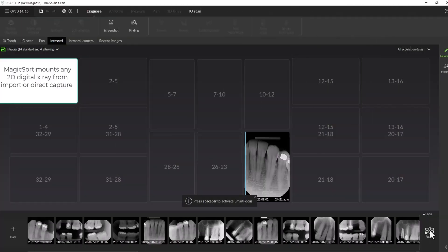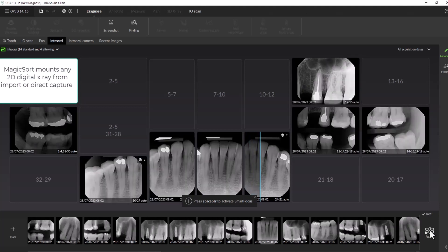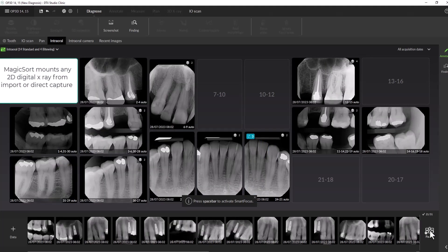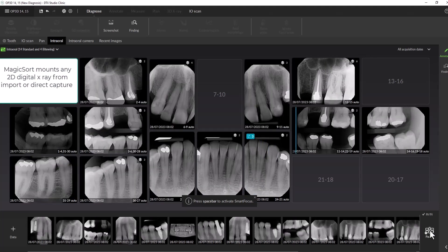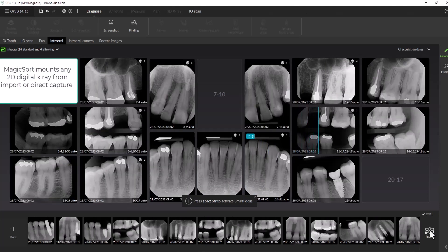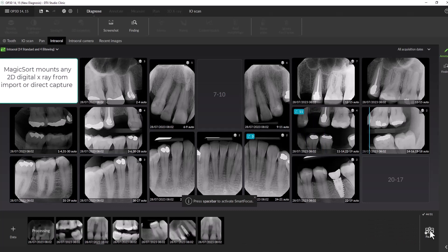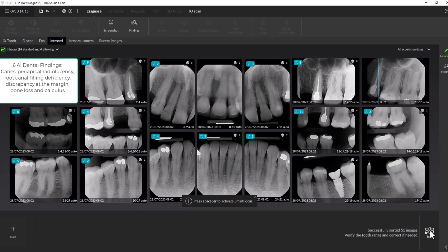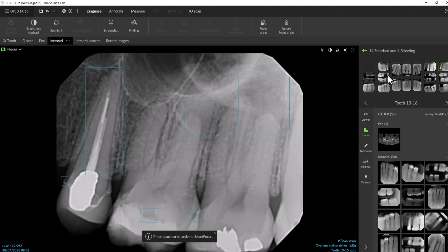MagicSort will mount any 2D digital x-ray, whether they were taken in DTX or imported from another office. 2D dental findings in DTX can detect six different findings, including these periapical radiolucencies found on tooth 15.